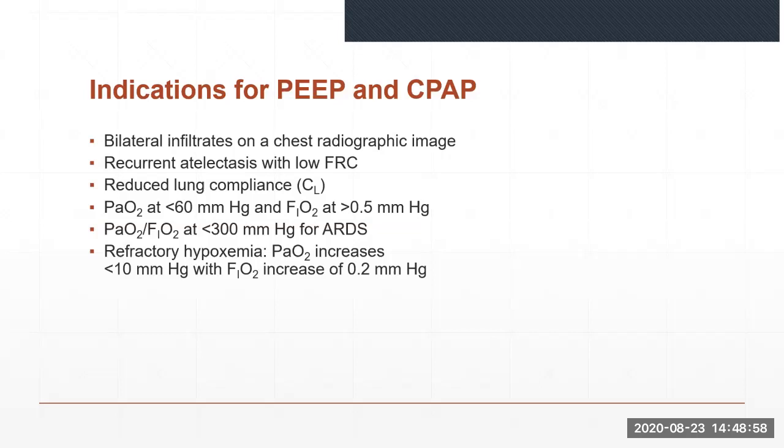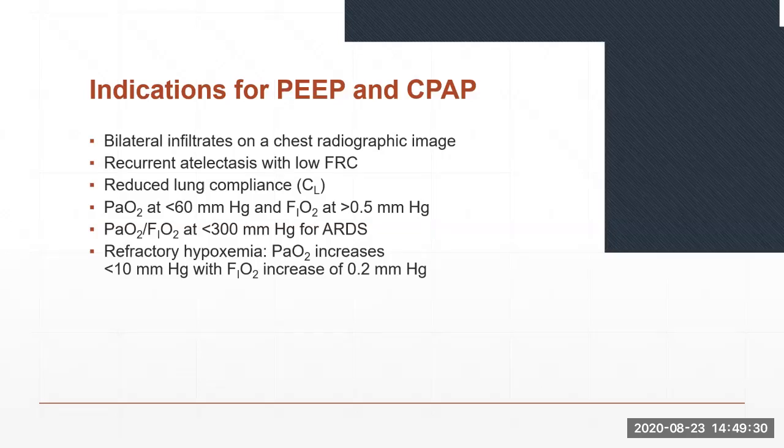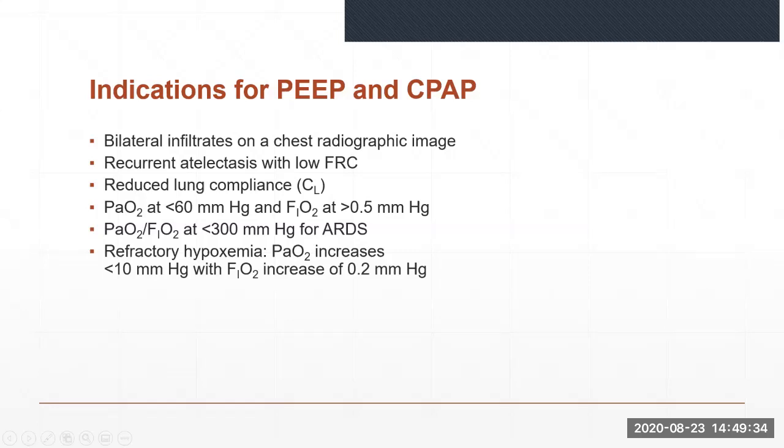The edema-filled alveoli may also have their volumes partially air-filled with this technique as well, leading to the restoration of FRC. Lung compliance and gas distribution are enhanced, thereby reducing the shunt effect of venous admixture and improving oxygenation.